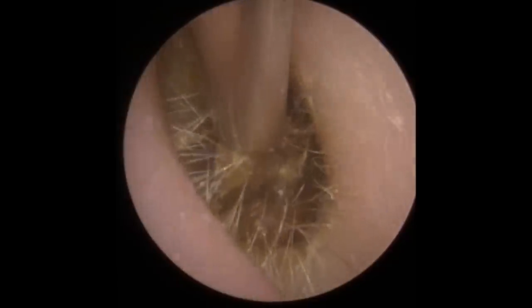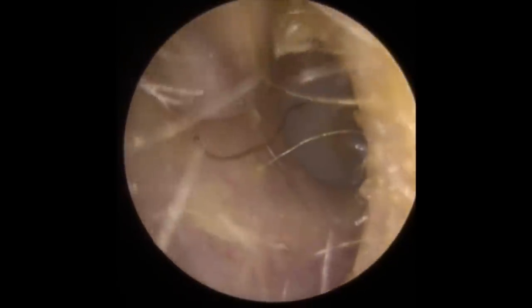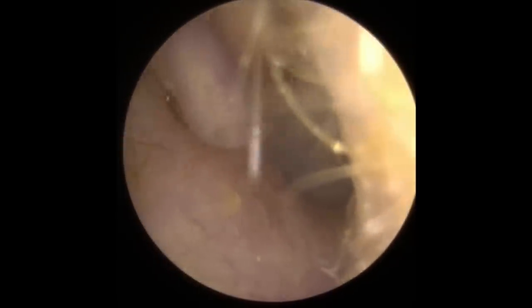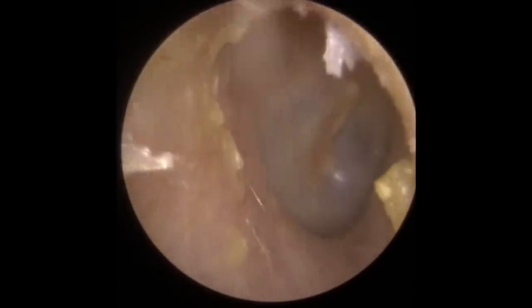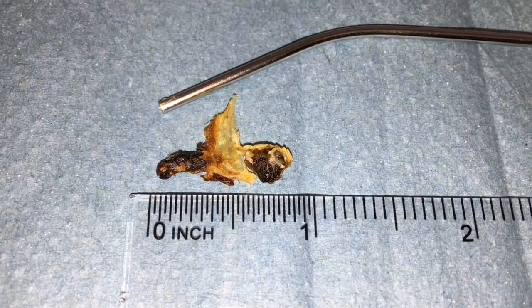The eardrum looks nice and healthy. This is the other ear - you can see lots of bits of hair on the outer part of the ear canal, probably from either ear hair trims or haircuts. It looks nice and solid on this side as well. So this is still the standard size Zolna tube we are using here. Just lifting the base there, getting a better grip - you can see how much quicker it is, coming away a lot more nicely. We've got a big dark hair in here, and I just wanted to show you how difficult it is to actually remove a hair using suction. You can see you are getting a grip on this hair and it is flicking back and forth. There we are - got the hair and that little bit of dry skin, and there is the eardrum. This is what we removed from the second patient - the first piece of wax is from the first ear, second from the second ear, shown in centimeters and inches.